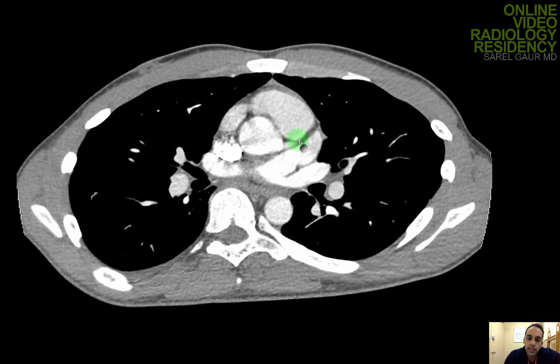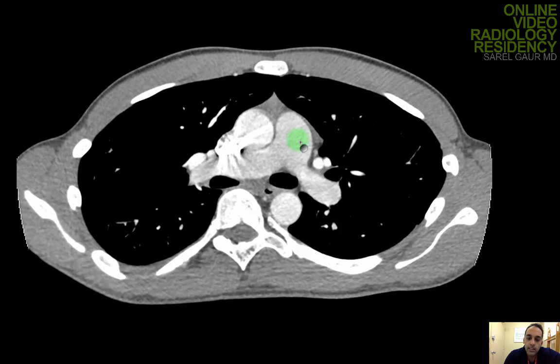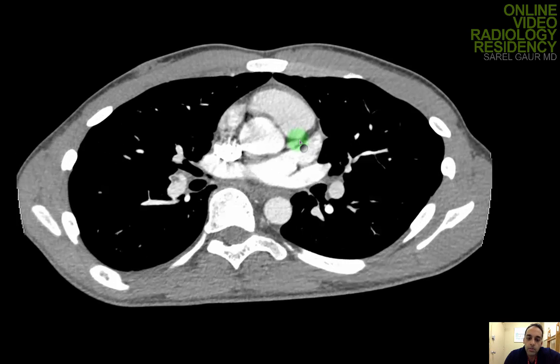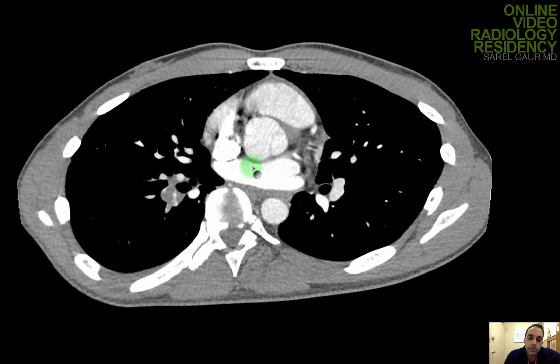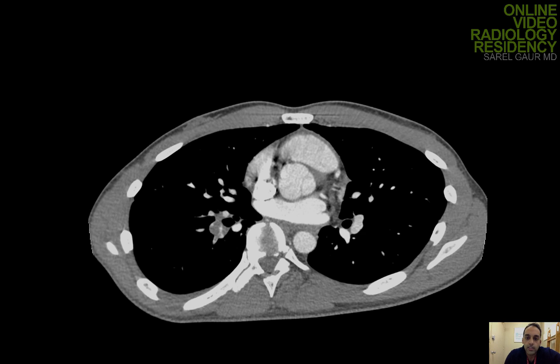This is definitely something you want to get on the phone about to make sure the ER knows that the patient has a pulmonary embolism with a Hampton's Hump or small pulmonary infarction. He's going to need to go on anticoagulation.